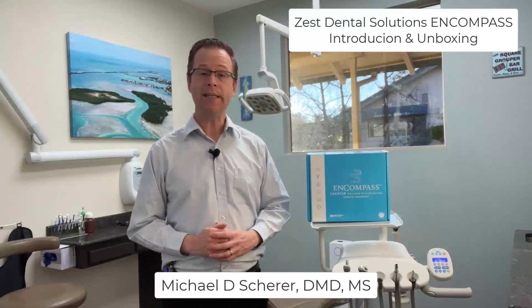Hi there, this is Dr. Michael Shearer, and in this video we're going to be taking a look a little bit closer at the Zest Dental Solutions Encompass solution.